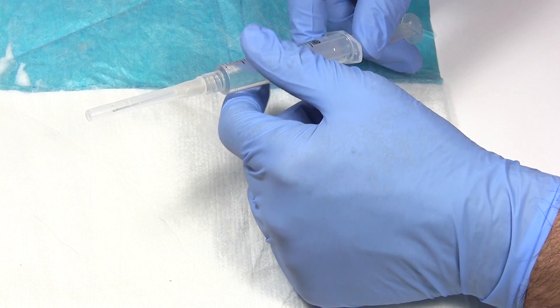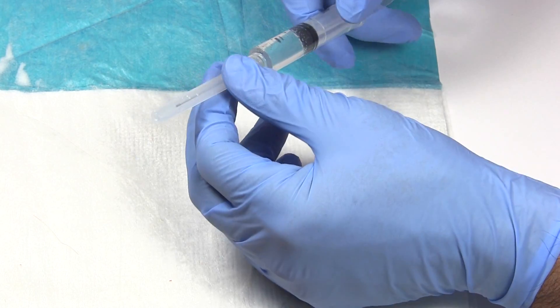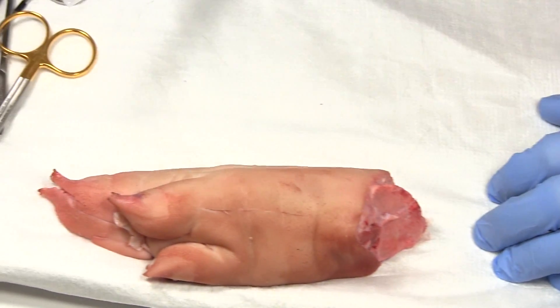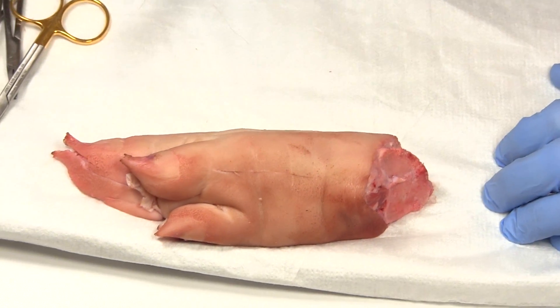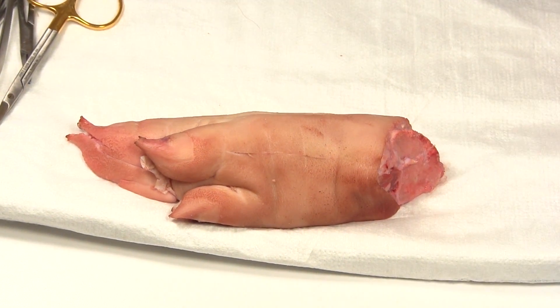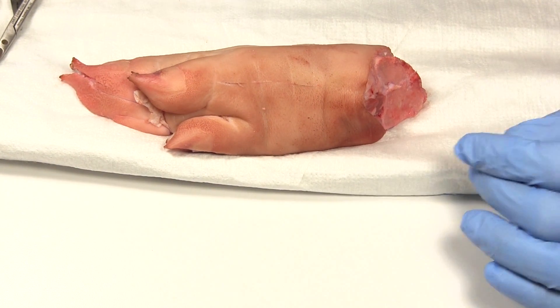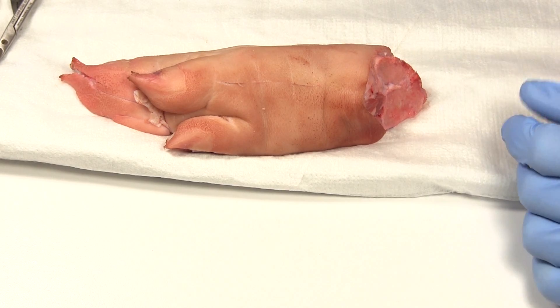Smaller needle causes less discomfort to the patient. And then you need something to sew. Today we have a trusty pig's foot — this is what a lot of people use to learn on in school, and that's what we're going to use here today.